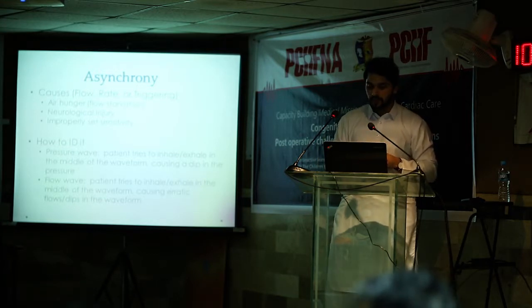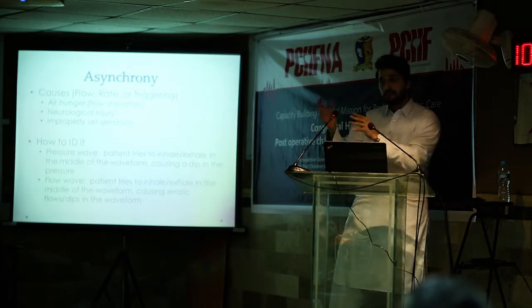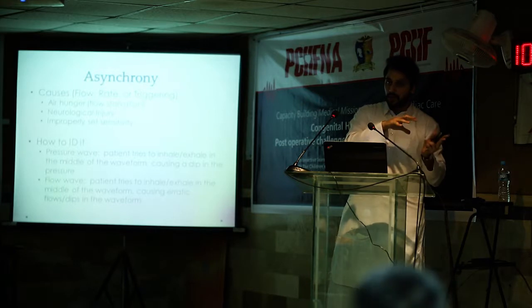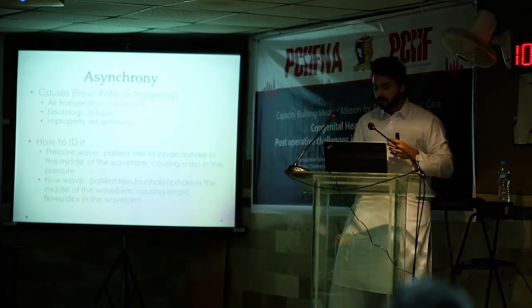You can fix the sensitivity. You can play with the IE ratio, sometimes change the mode itself. For example, he's in SIMV and he is asynchronous. If you put him in assist control, he will get more support from the ventilator. He will relax and he will be synchronized well with the ventilator.